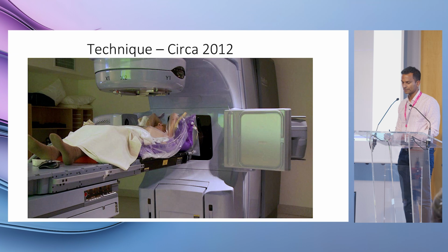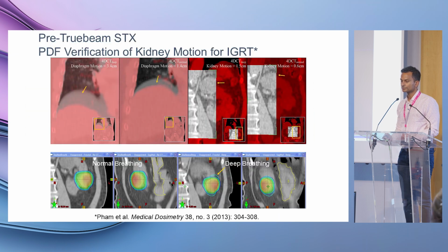location and tumor motion. So we can see relatively good images, but we don't see very good quality of where the tumor is in relation to the kidney. It's mostly that whole area, the kidney and the tumor together, that we're looking at.